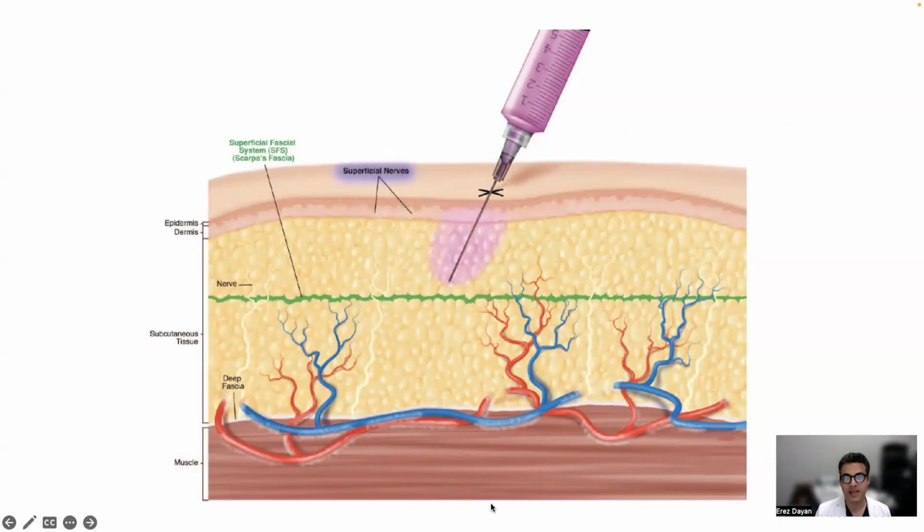So this is applicable to any place in the body: neck, abdomen, flanks, thighs, arms. And typically, there's a couple ways to do this. The first thing I would suggest is, while the patient's in the pre-op area, create your marks, create where you want to have your access point, and then put a little bit of topical numbing on that area. I think even for the patient psychologically, they like to know that there's some topical numbing there. Let it sit for half an hour while you're getting the patient ready.